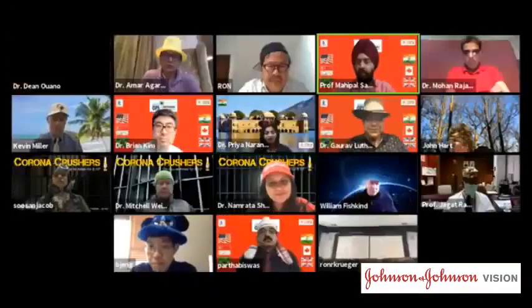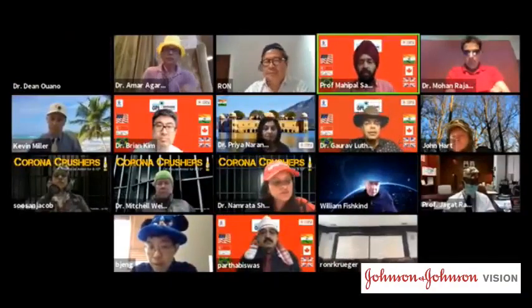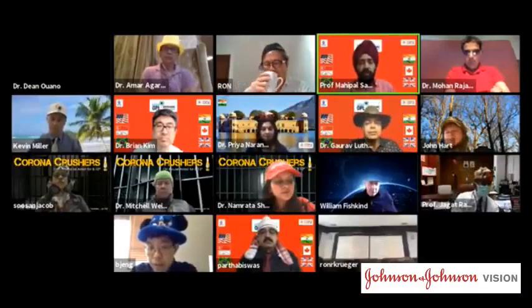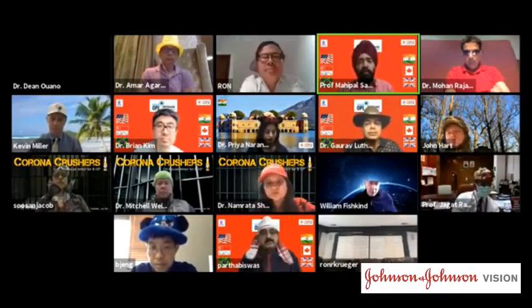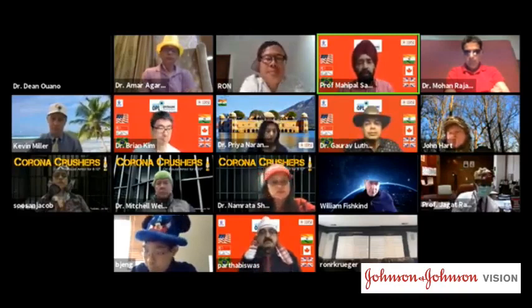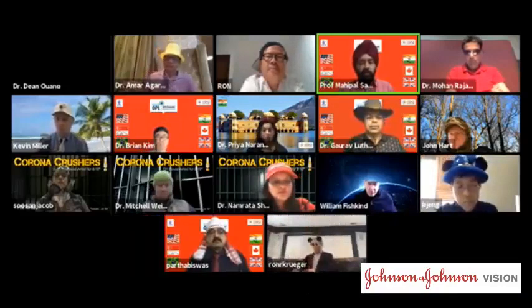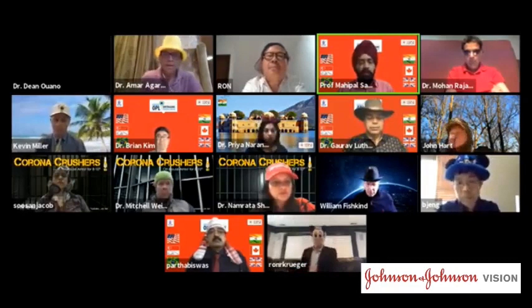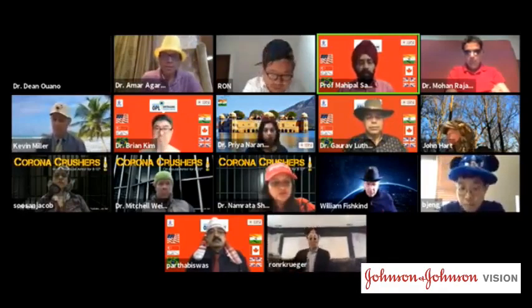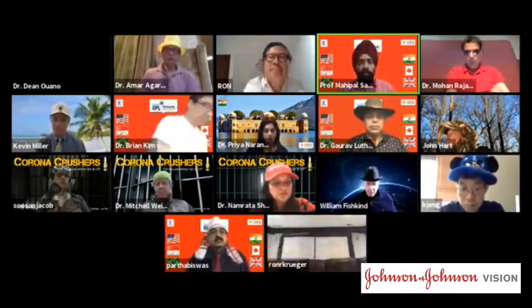Well, I think what Suhas said and what Amar have been saying is that these are for desperate cases, and the basic concept is that you're making the pupil small and you have depth of focus. And obviously, these patients are pretty happy with these. There are obviously questions that come up about the restriction in the field of vision if the pupil goes down to 1.5 millimeters or something like that, as also watching the periphery of the retina.